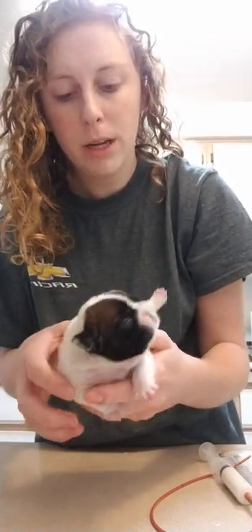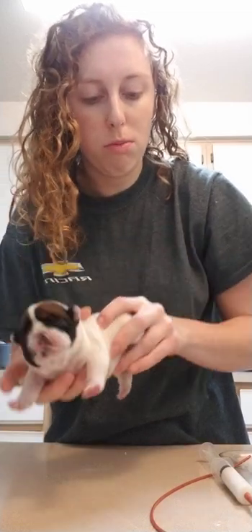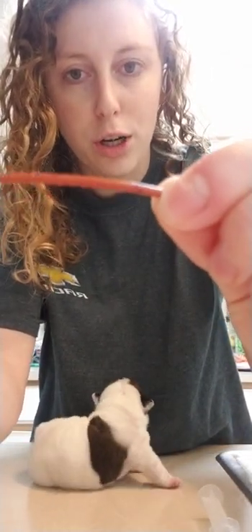Whenever you measure a tube, you have to go from the end of their last rib all the way to the tip of their snoot to measure the tube. I have this already marked, as you can see, and you'll make a little mark with a sharpie.